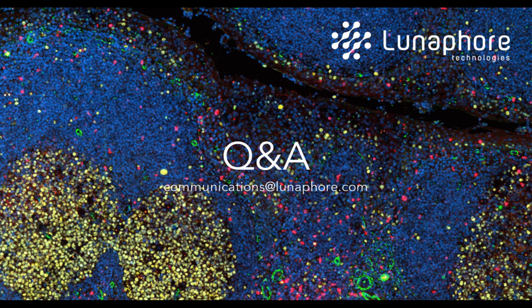And actually connected to this process, the last question asks, is the registration software included when multiplexing? Yes, absolutely. So the software that we provide with the instrument will give the images already stitched, registered all together as one mosaic, let's say, in OME-TIFF format, so that you can downstream open it on any image analysis or tissue analysis tool that you'd like to use.